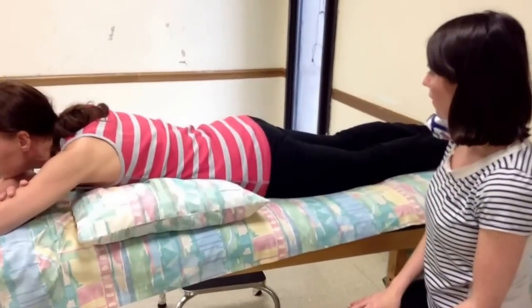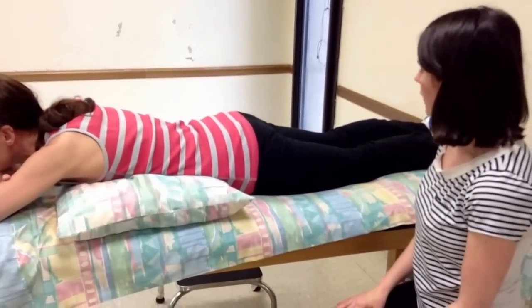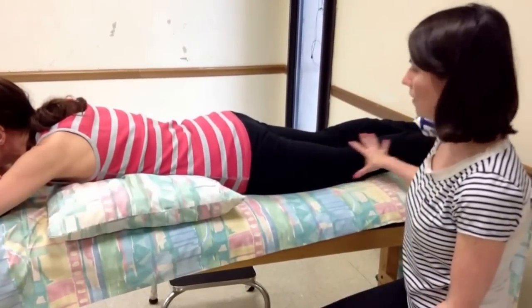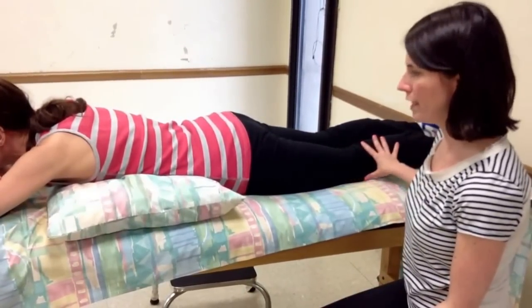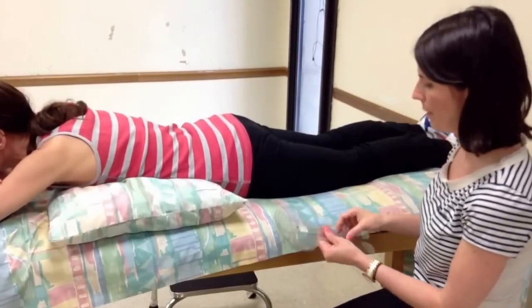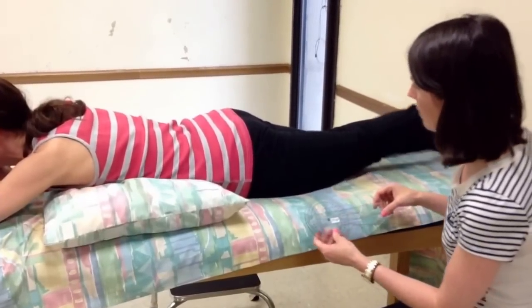The instruction to the patient is: I want you to keep your leg straight, or your knee straight, and I want you to lift your whole leg up off the bed as high as you can.